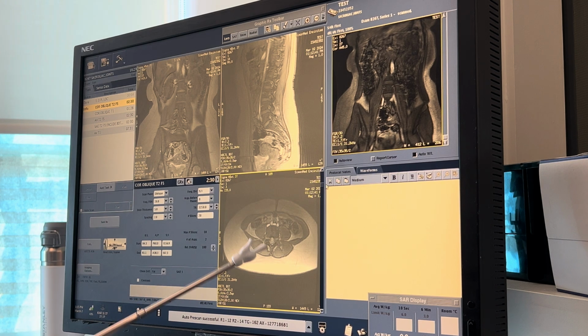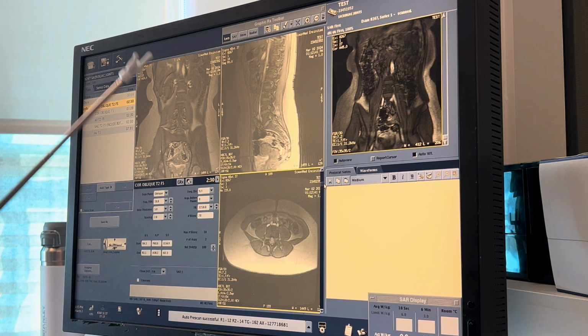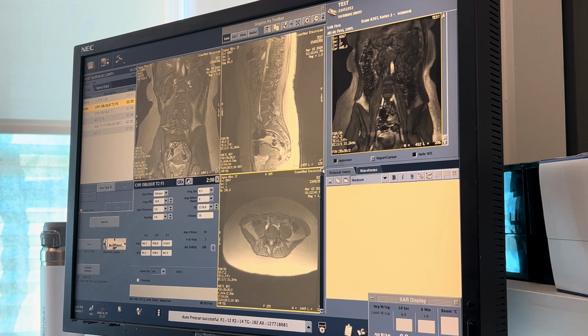So you can see that we're in the lumbar region. Here you can see the vertebral body, lamina, spinous process and whatnot. So we're actually going to go up. One more. Last one. Oh, that's okay. We are landmarked pretty high up.